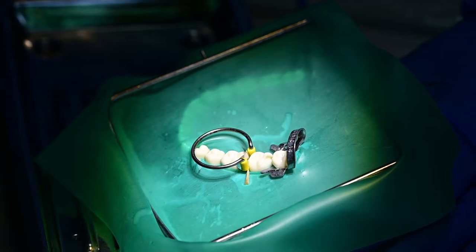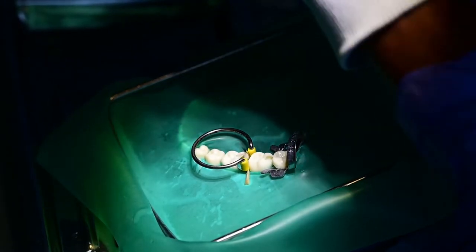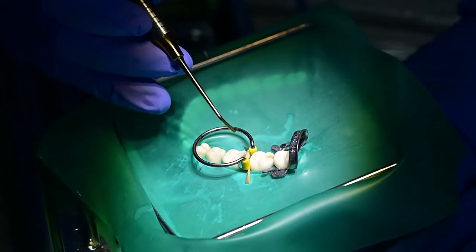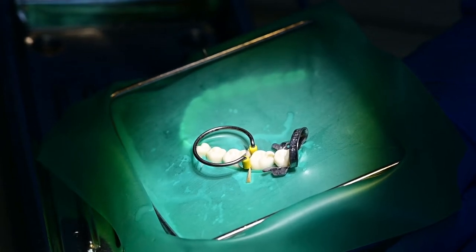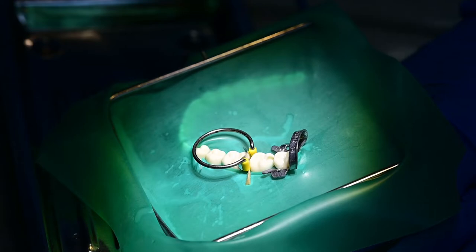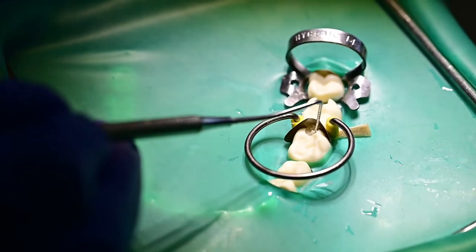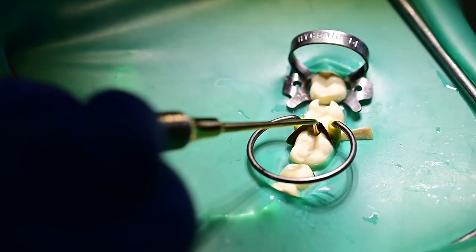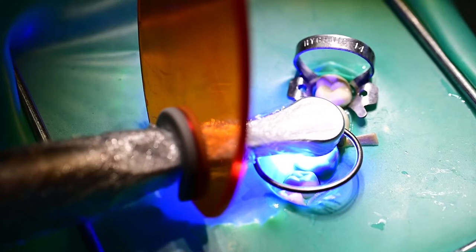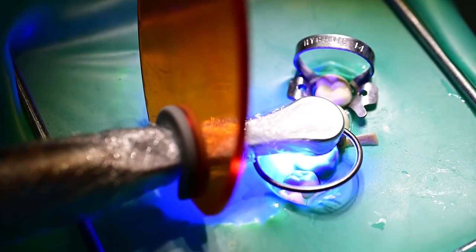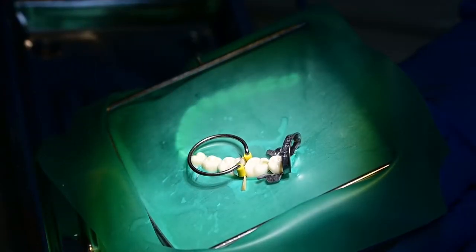So I am going to now dispense the material into the cavity, four millimeters. I want to pause and ask a question. How would you tell that it is 4 millimeters? Because we say bulk fill you need to do 4 millimeters but how can we tell that it is 4 millimeters? Actually you can use your periodontal probe and measure because you know your periodontal probe is graduated and so you can actually use it to measure. Like now here I have only 3 millimeters actually. And then I will be light curing it for 20 seconds. As you can see the light curing unit is having the pulse delay strategy where after every so often it goes off. That is 20 seconds. It is meant to control the polymerization shrinkage.